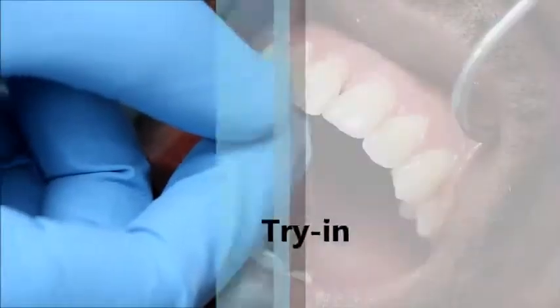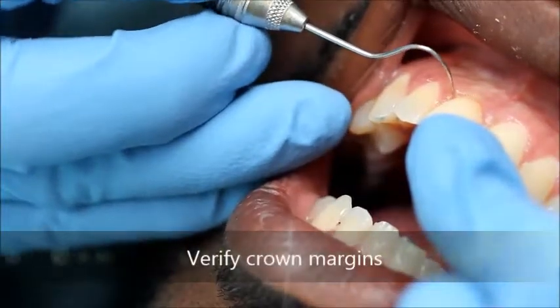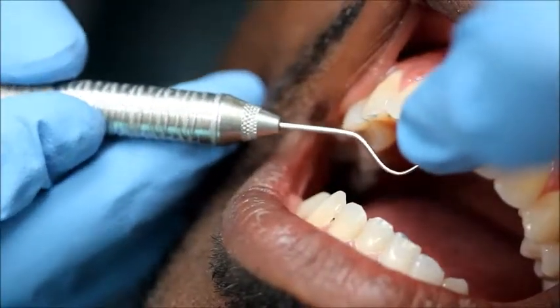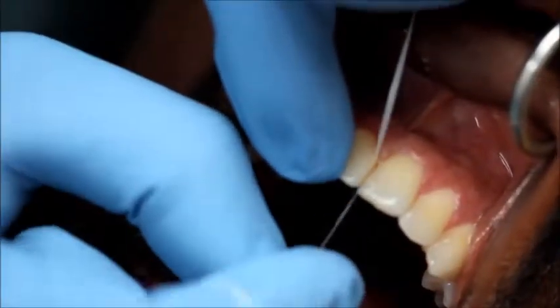Before final cementation, the crown is tried in. Complete seating of the crown and accuracy of the margins are examined by probing the interface between the tooth and the restoration with an explorer. Contacts are verified, and if they are deficient, the crown is taken to the lab for addition of porcelain.